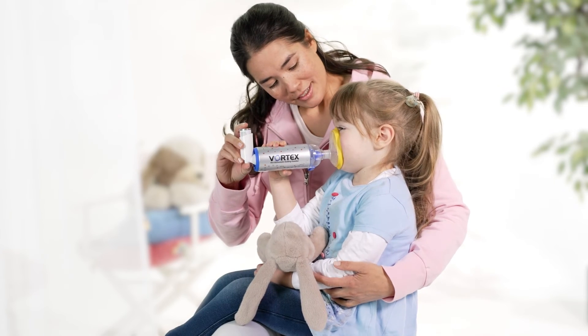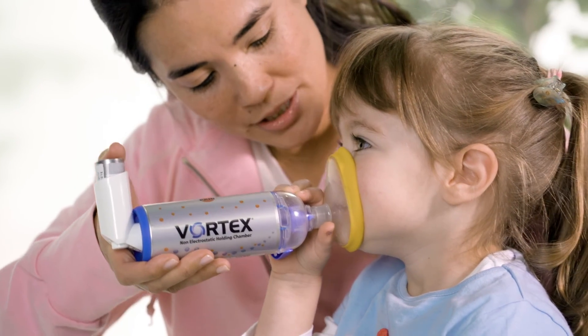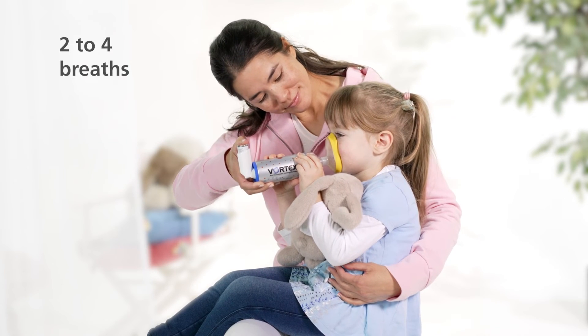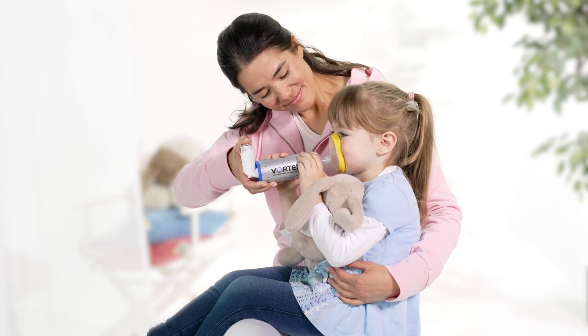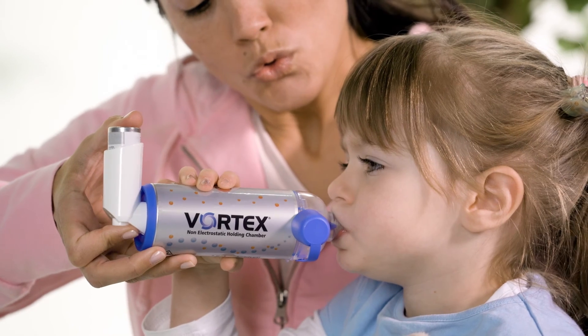The metered dose inhaler should be triggered just before inhalation. Unless otherwise instructed by the doctor, children older than 18 months should inhale and exhale two to four breaths through the mask. Children should switch to the mouthpiece as soon as they are able to.